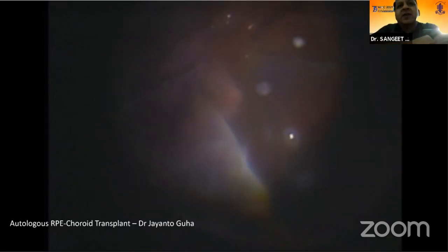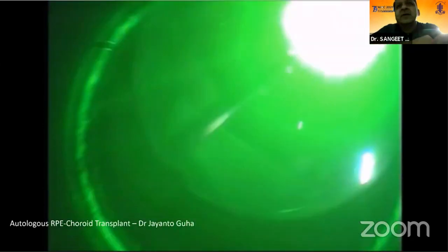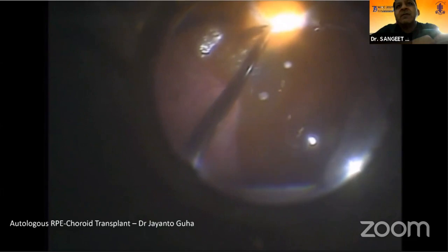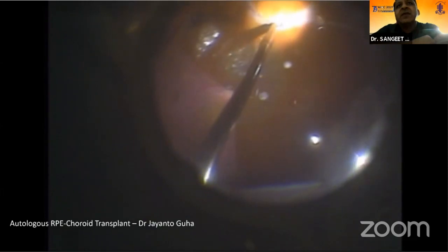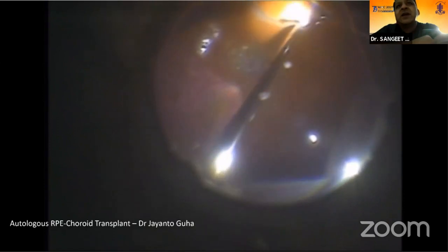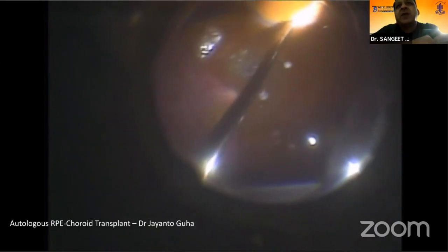Then by using diathermy and by using laser, he marks the area where he has to create a graft. With the help of an intravitreal scissor, he just dissects one graft, this RPE choroid graft.